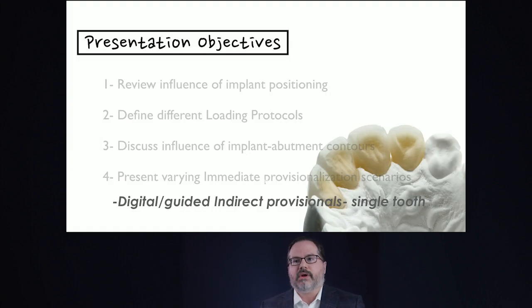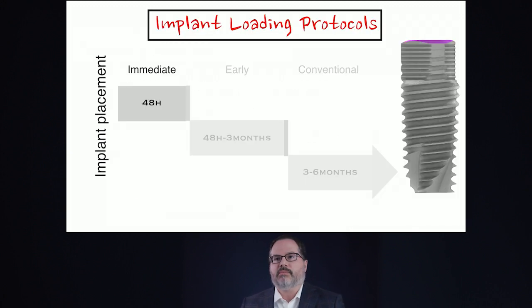So the last category we're going to talk about is the digital or guided indirect provisionals for immediate placed implants. And this is going to be all digital, and everything is going to be made ahead of time according to our plan, including the provisional. So this is going to be the immediate loading protocol here.